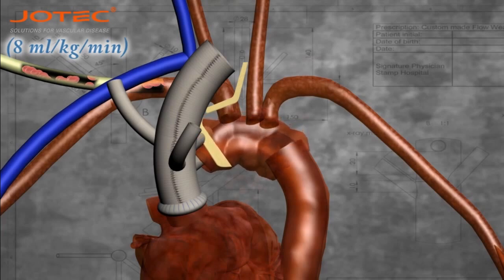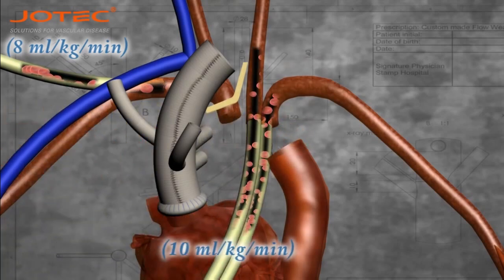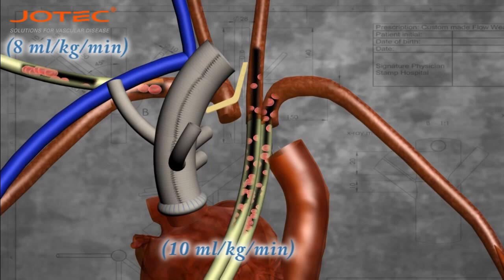Resection of the aortic arch. Two separate cannulas will provide perfusion for the left carotid artery and the left subclavian artery.